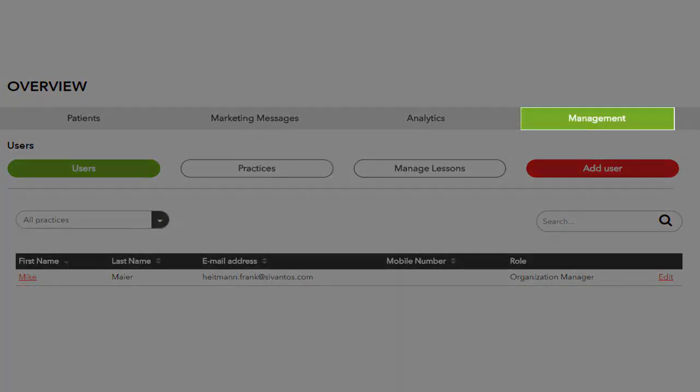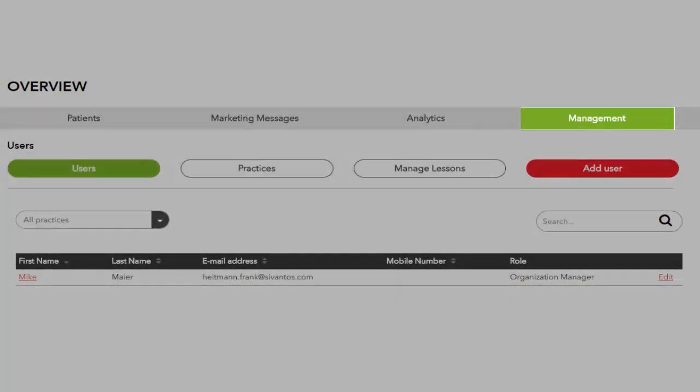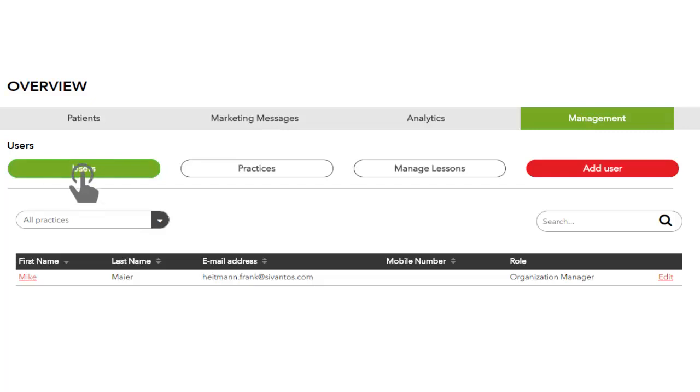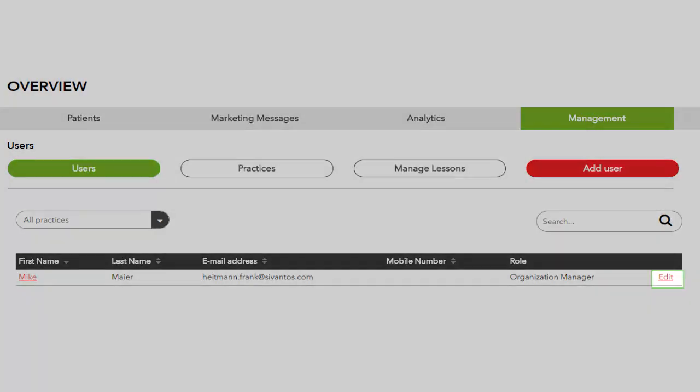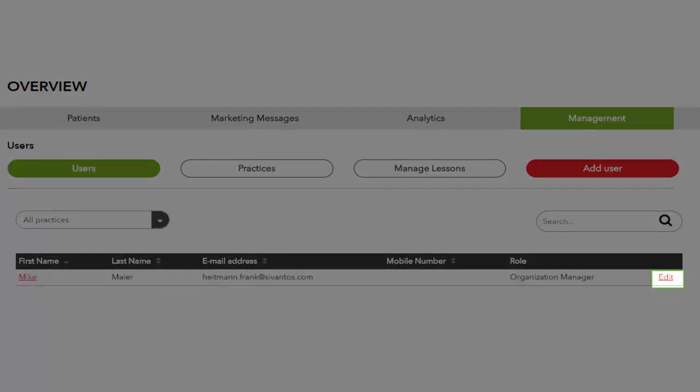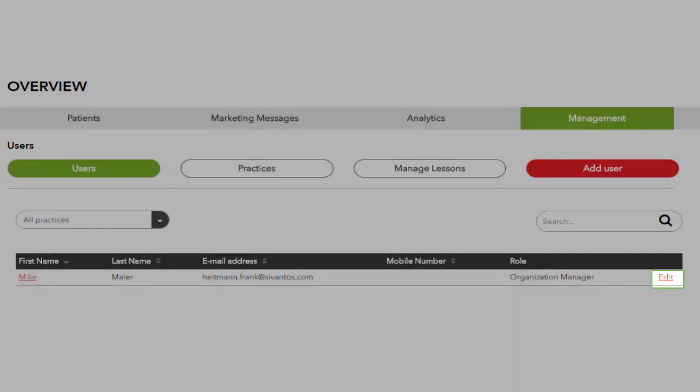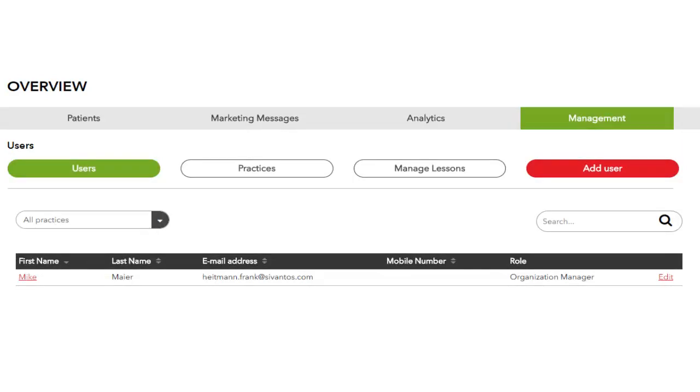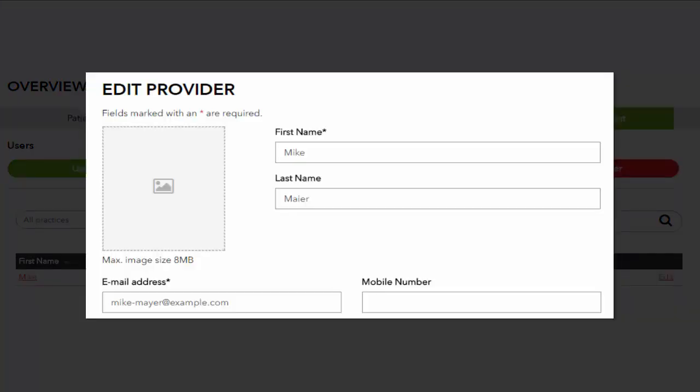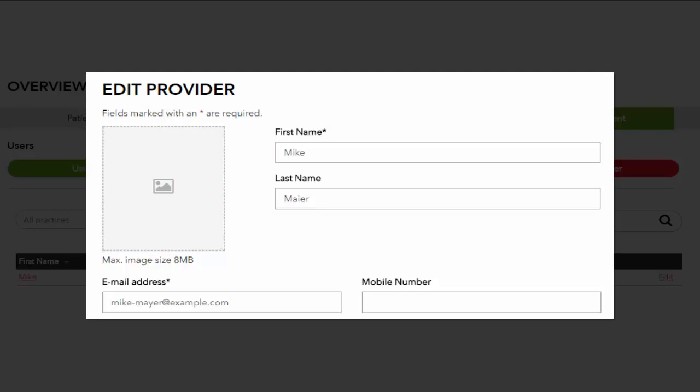From the main menu select Management followed by clicking Users. In the Users Overview list click Edit to view your profile details. Edit your personal details and upload a professional photo if desired. Click Save.